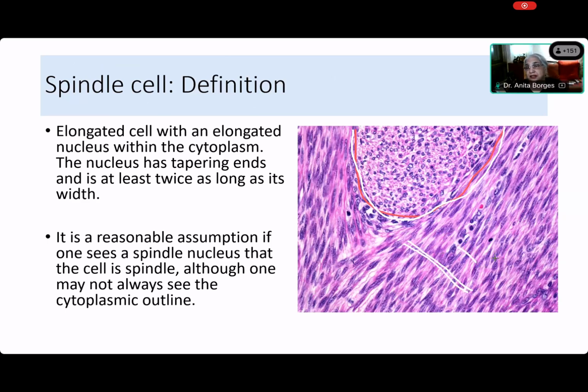So this is the first thing that we have to learn about spindle cells, that they may look round. That means the nuclei will look round, and their cytoplasmic borders also will look round. And there were several people in the chat box who said the same thing. All right, let's go to the next slide.